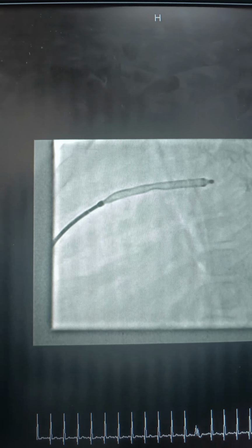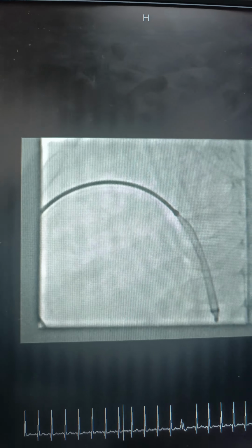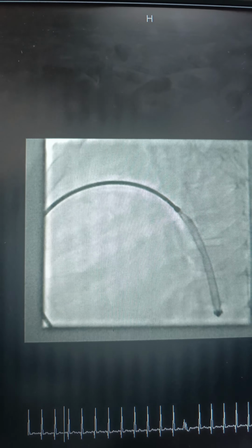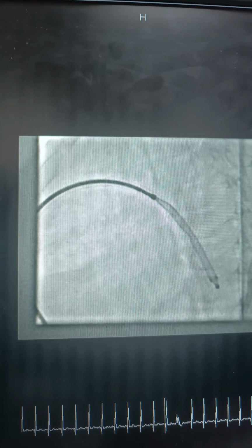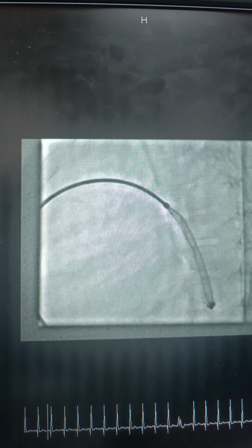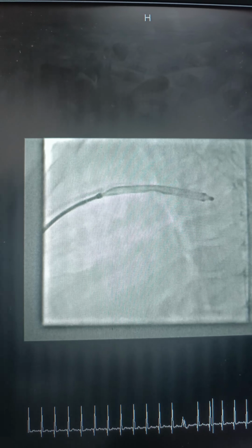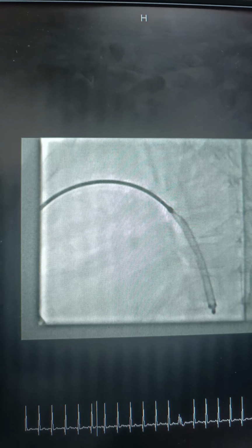Now you are pulling it till it becomes horizontal through the PDA. Yeah. Now it has come inside the PDA almost. So when you release it, the dictum is to try to release the first disc fully into aorta or at least half exposed into aorta. Then you pull the device and see the previous stored landmark or the pressure or the decrease in bobbing of the sheath. There you try to release the second disc.